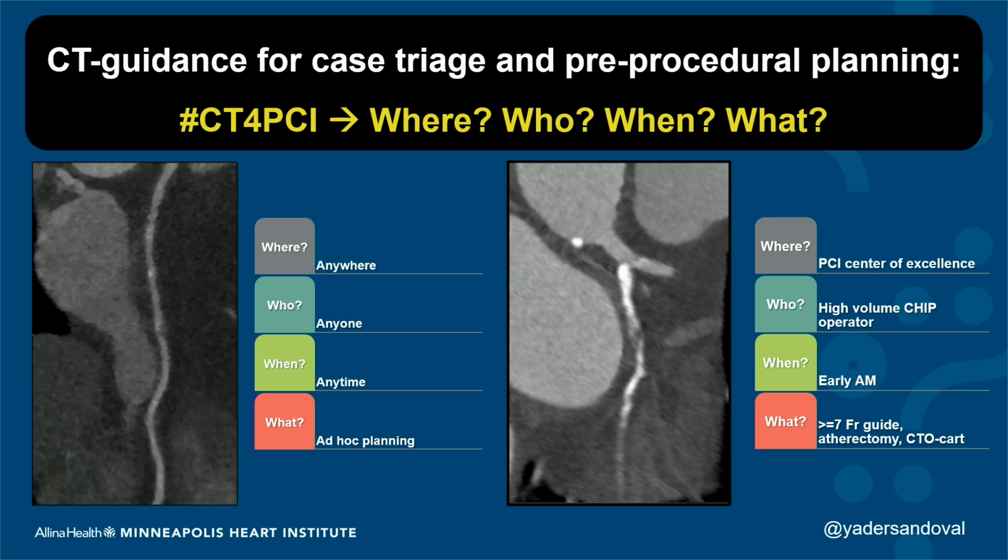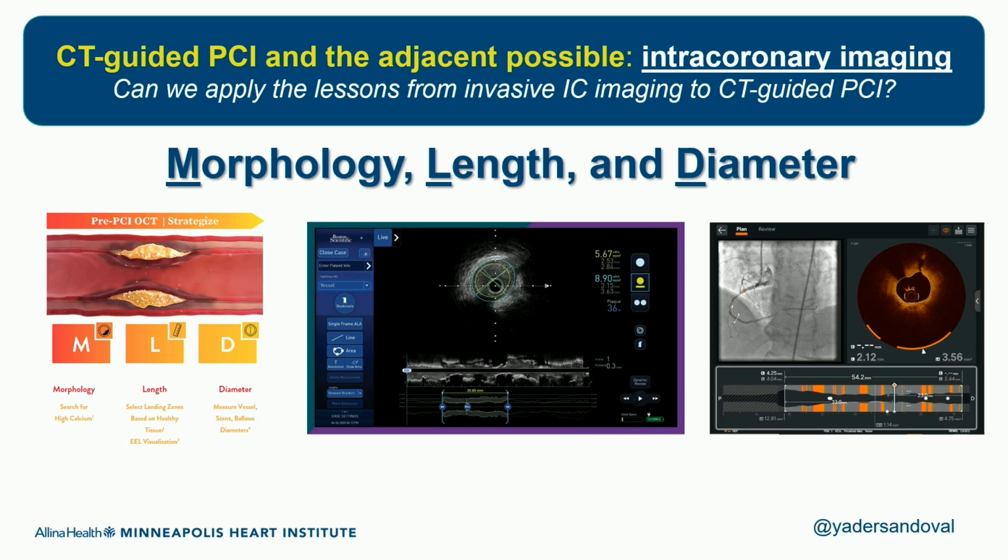This is something that we as interventionalists and your colleagues in the cath lab have not really been looking at, because we have not been thinking of the test as a therapeutic test, but we have historically used it only as a diagnostic test. You can see there's a lot of opportunities.